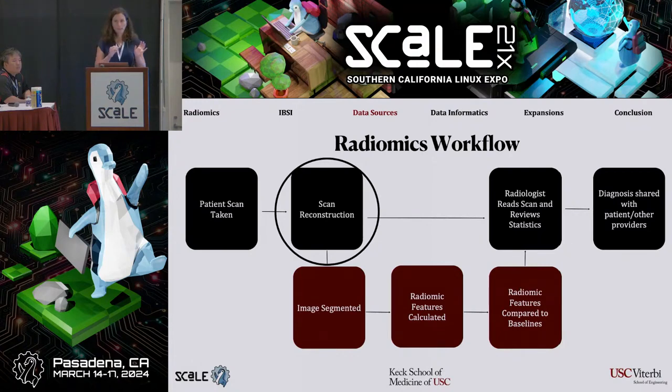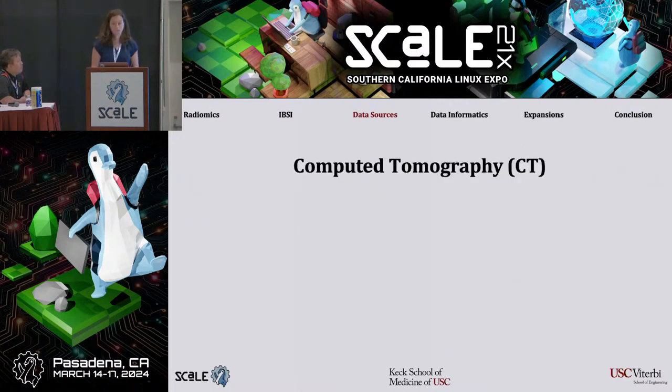We can't send over all of the 1D line integrals from a CT reconstruction. So with these variations in reconstruction, that essentially corrupts the data we're looking at. So trying to figure out what these reconstruction differences are and how to account for them in our models so that we are assessing biological difference rather than mathematical difference was one of our goals with this recent project.